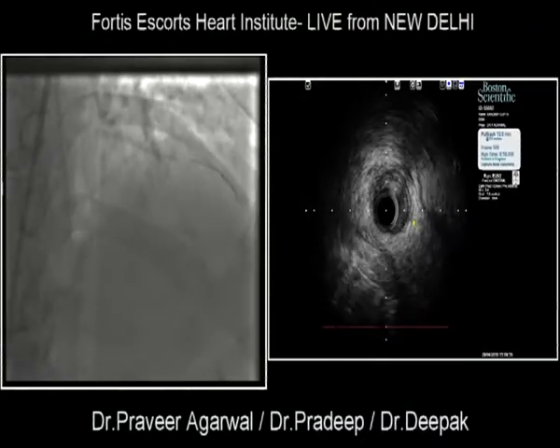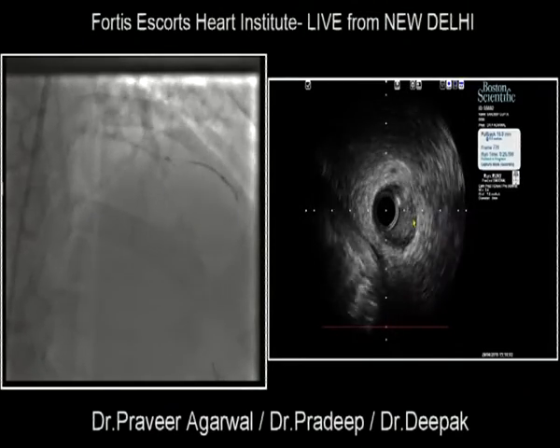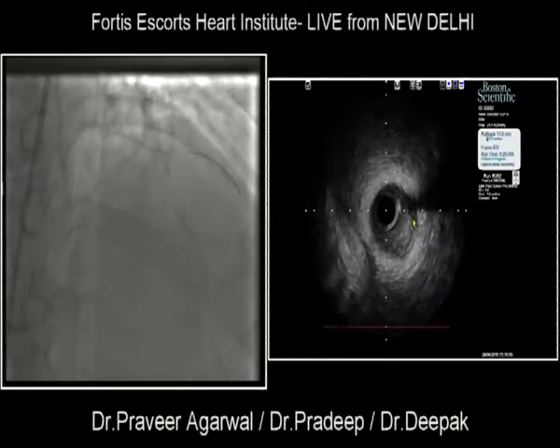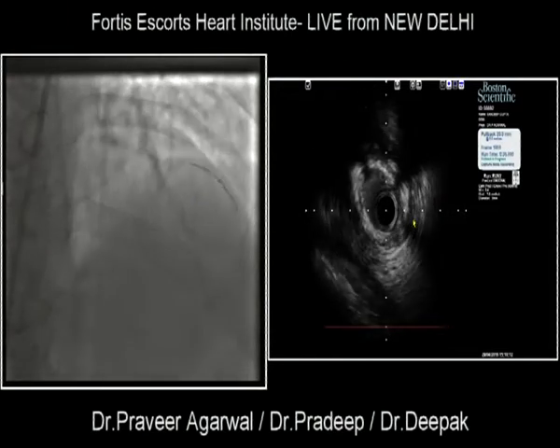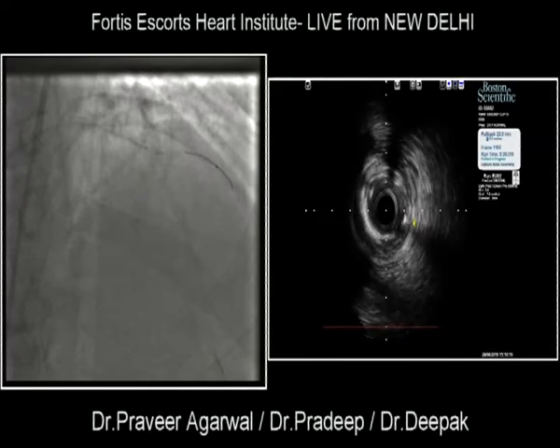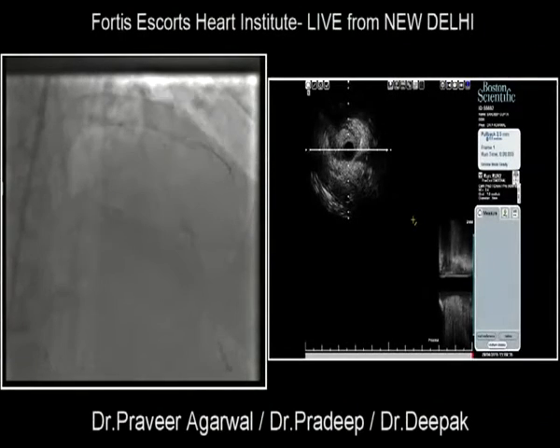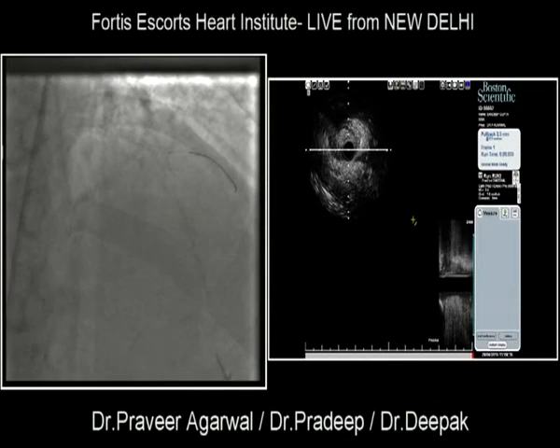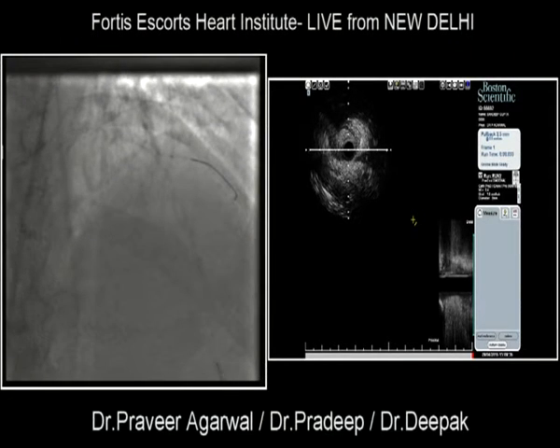I understand you measure from external elastic lamina to external elastic lamina, yes? You mean it's larger? We are coming close to the ostium now. Okay, thanks. So now we need a 2.5 scoring balloon. It looked 2.5, didn't it, distally, when it was healthy? Yep. Yeah. 2.5? Okay.